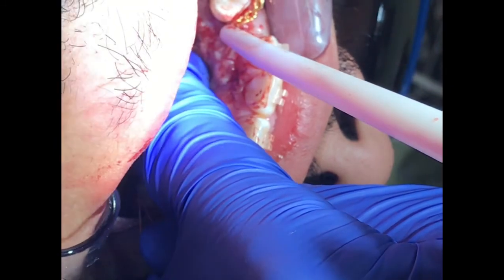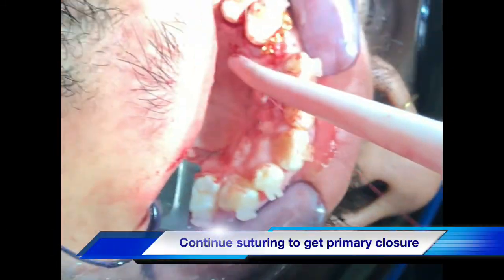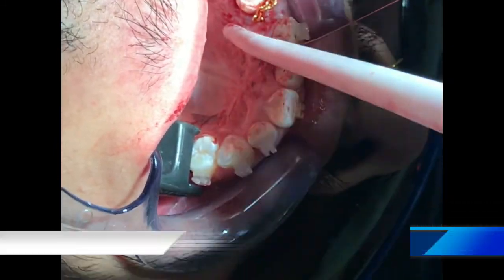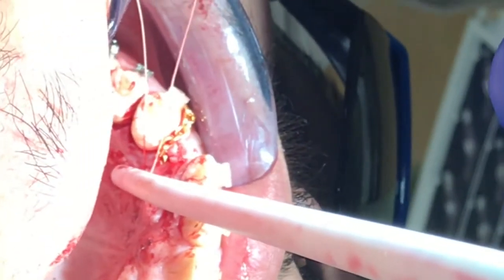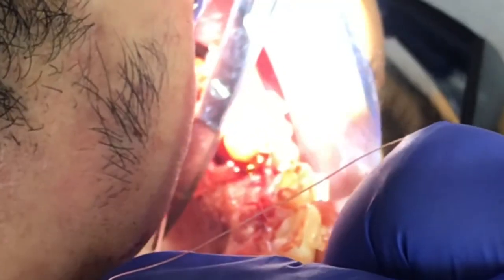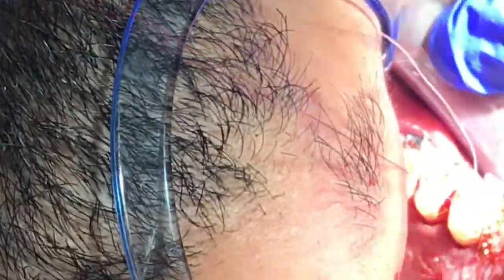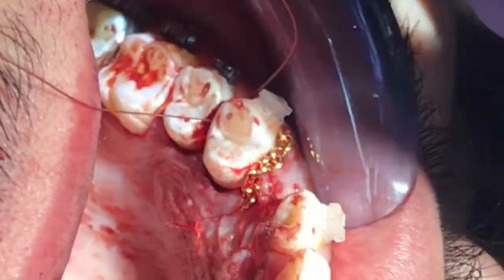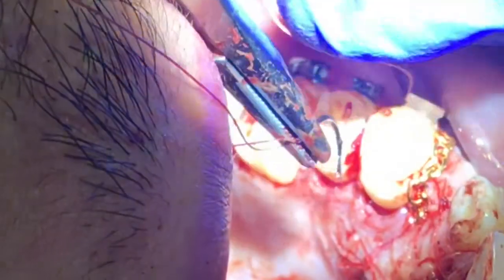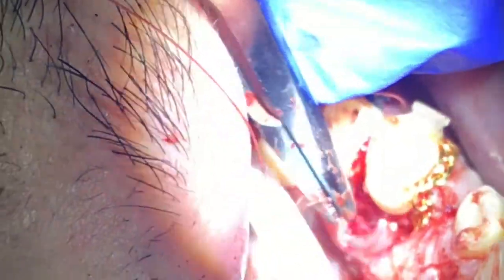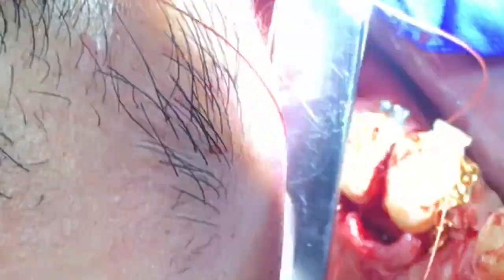During this procedure, the patient is asleep. Either the patient will be on local anesthesia with oral sedation, or local anesthesia with IV sedation.